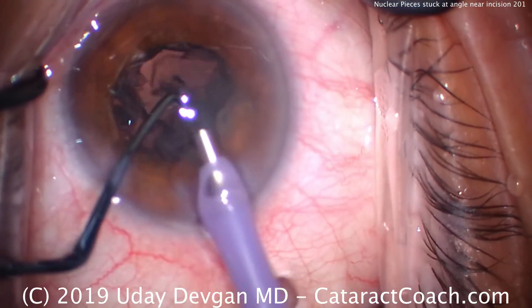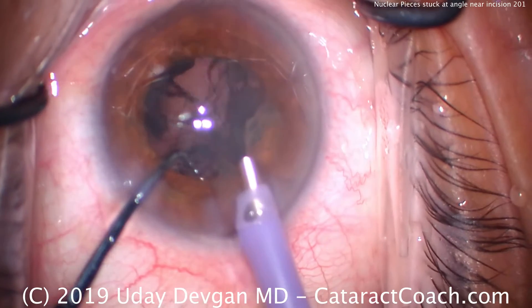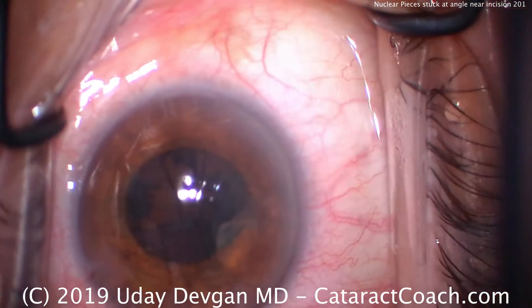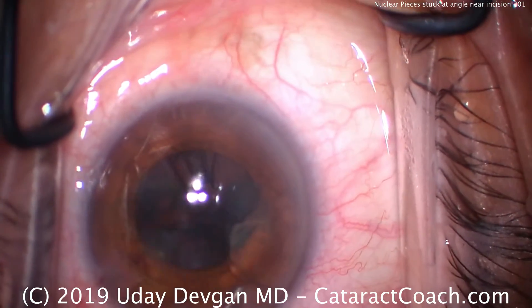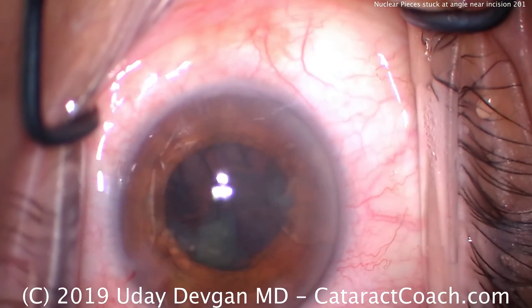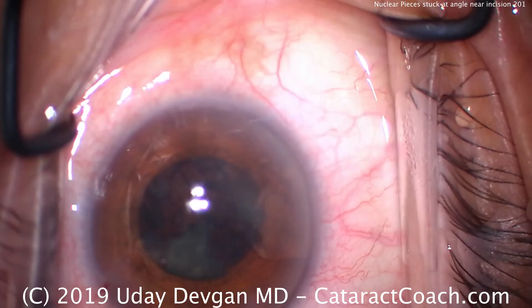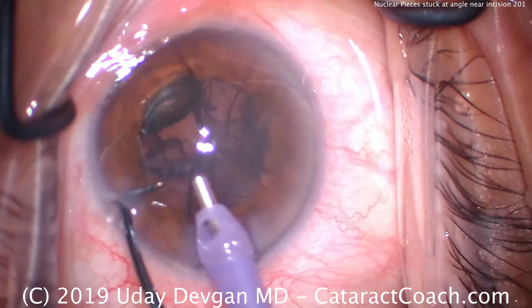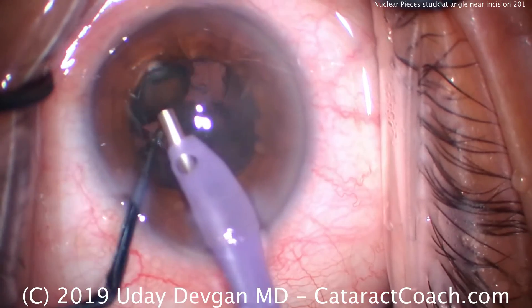Last few pieces. Now look — just to the right of the main incision there's a piece of nucleus. I don't want to risk trying to pivot and pull out of the eye and lose infusion. So I'll just come out, use balanced salt solution on a blunt cannula, and just hydrate and push that piece — wash it out of the angle. That's a much safer option.